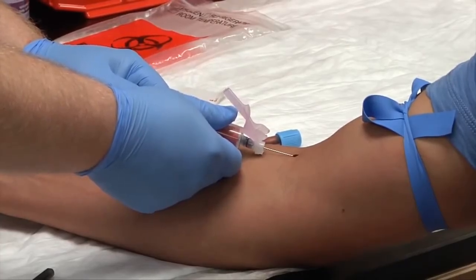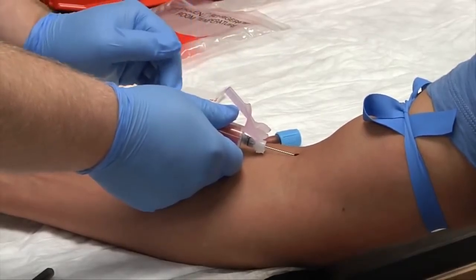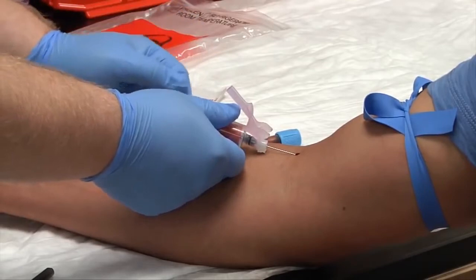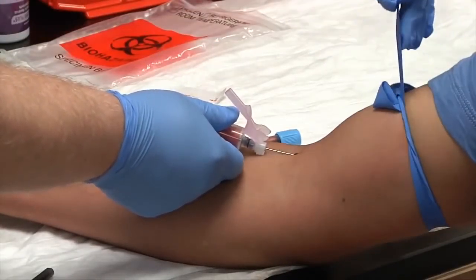And one thing that you can look for to help you tell when the blood is done is it shimmers as it's moving, as it moves in. Once it stops shimmering, more likely your tube's full. And this tube is full. It's my last tube, so I'll release my tourniquet.